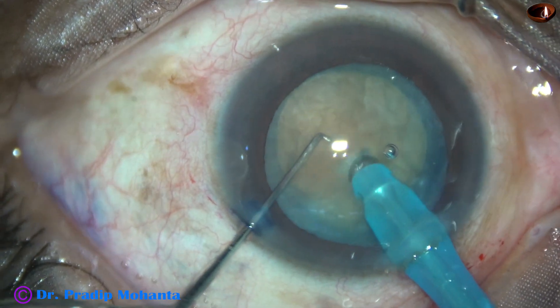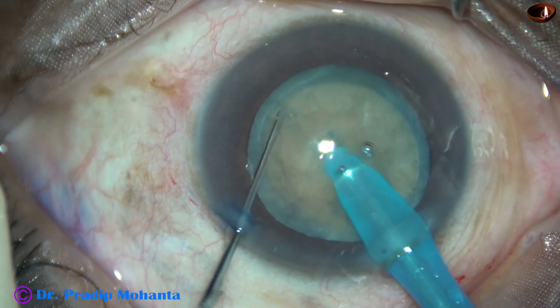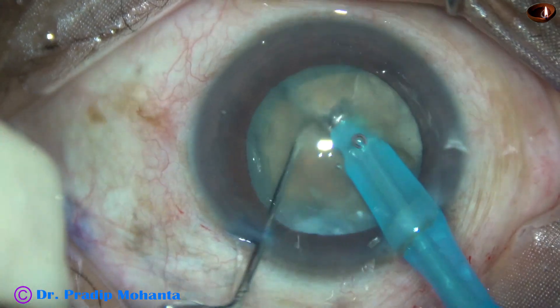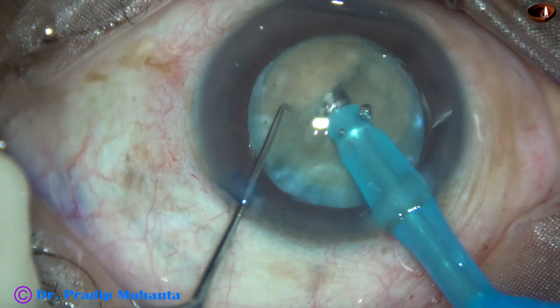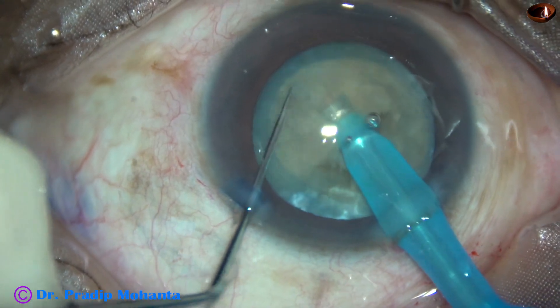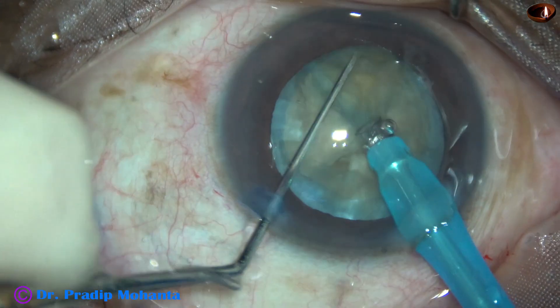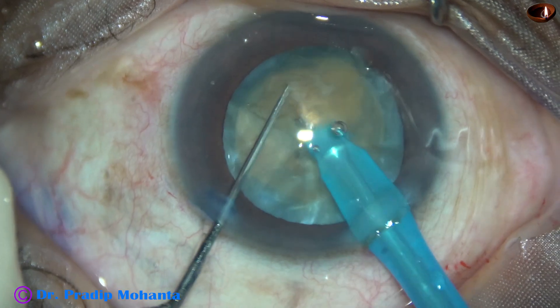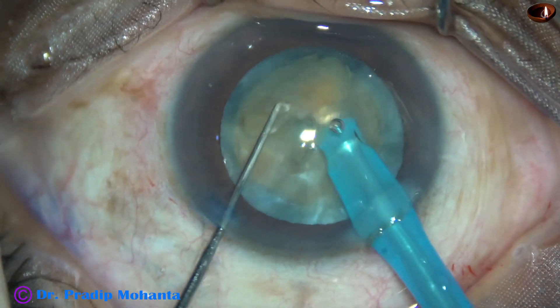Now watch submarine chop. The phaco needle travels through the substance of the nucleus. As it reaches near the opposite equator, the nucleus is chopped. One hemi-nucleus is chopped again. This free nuclear fragment is being emulsified.